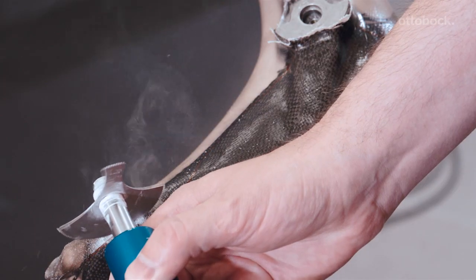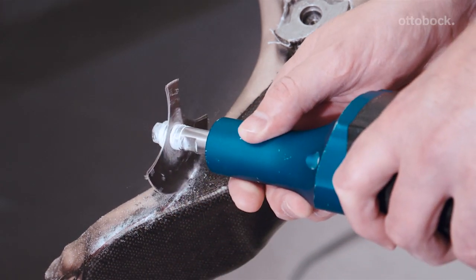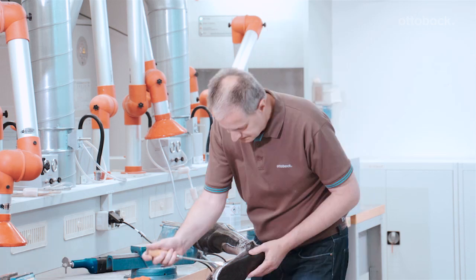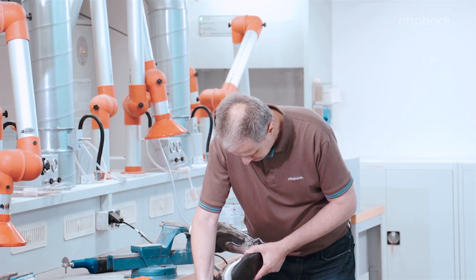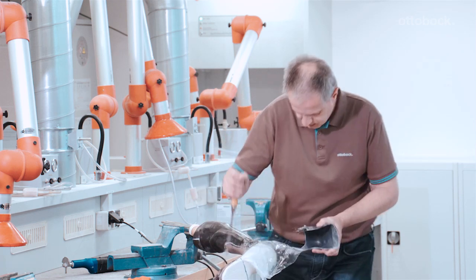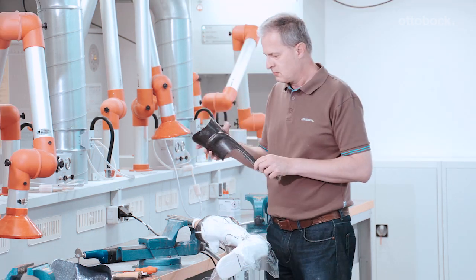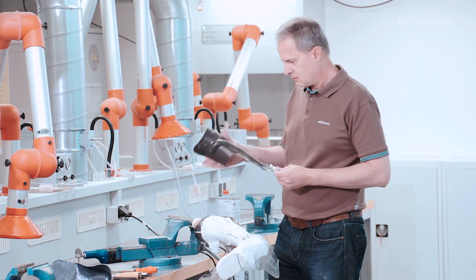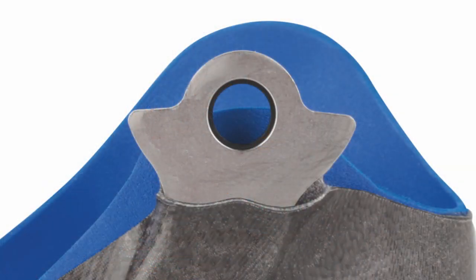Use the oscillating saw to cut the deforming edges free. Then remove the components from the plaster. The foot component now has a clear opening for the unilateral ankle joint.